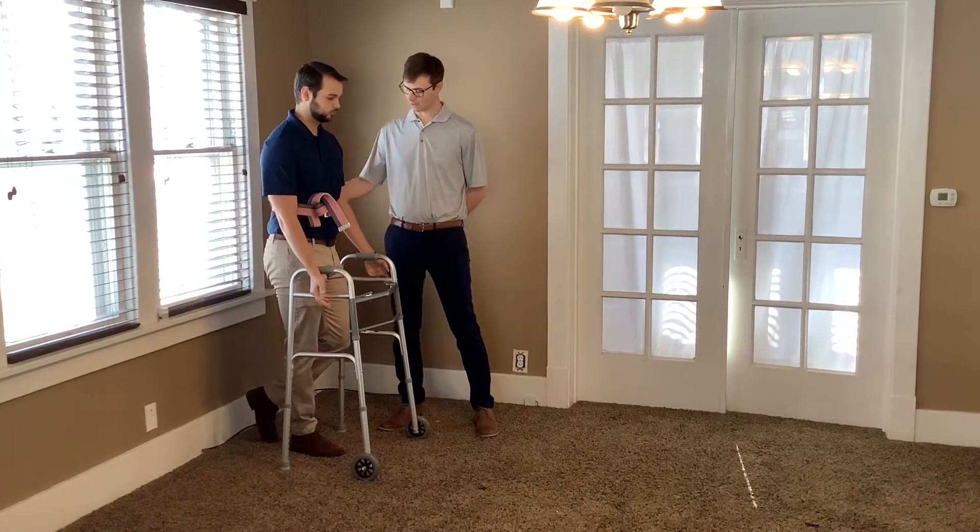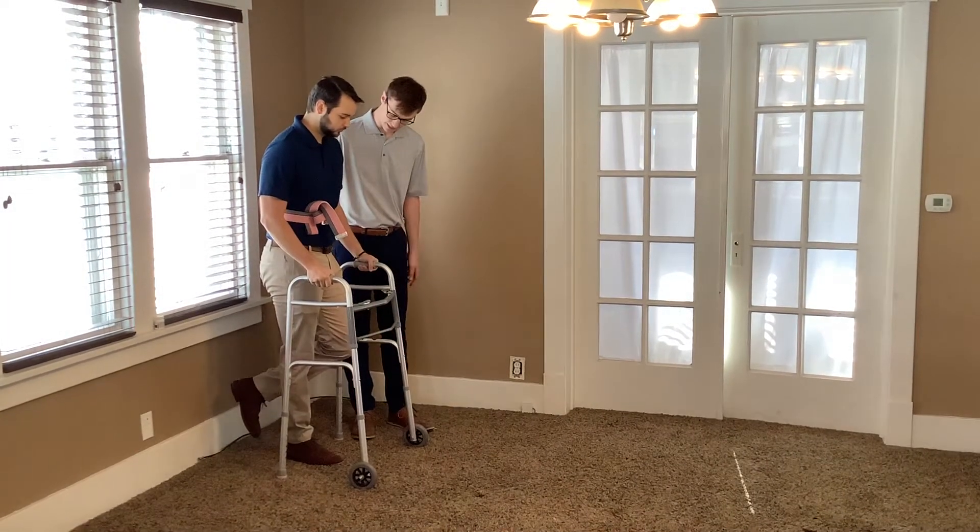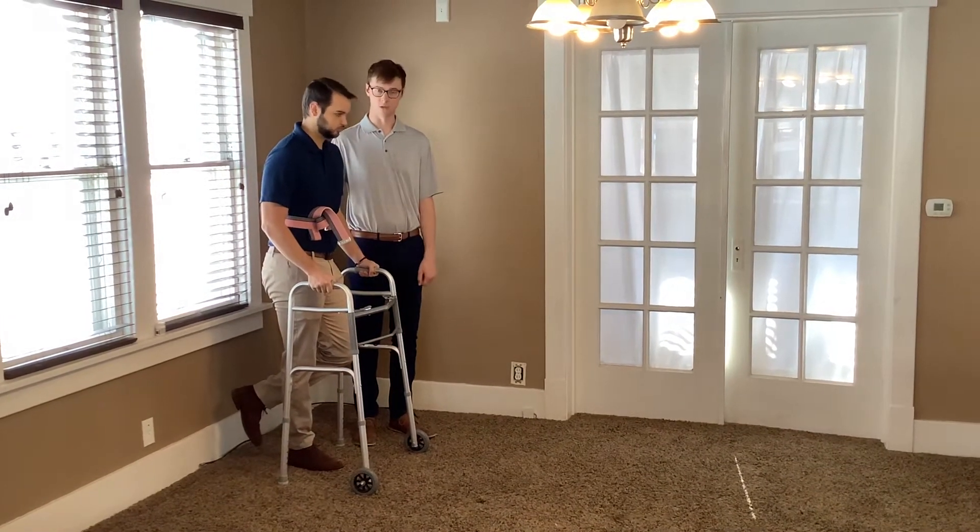We have a gait belt on for safety, so I'm going to stand on his affected side, which is his left leg right now, and we're going to teach him how to walk with a walker.